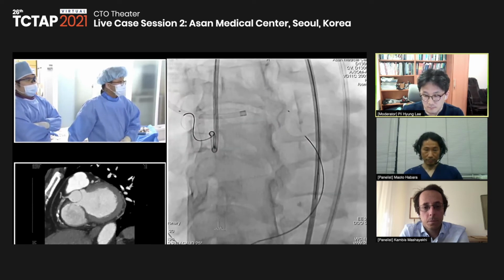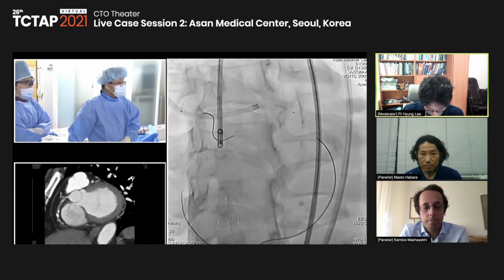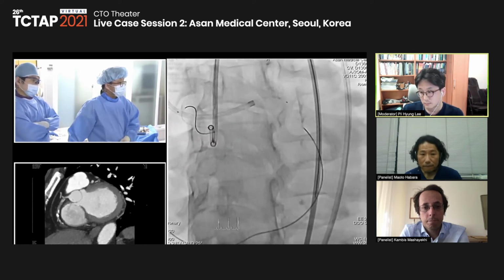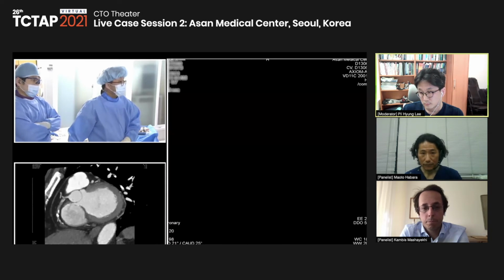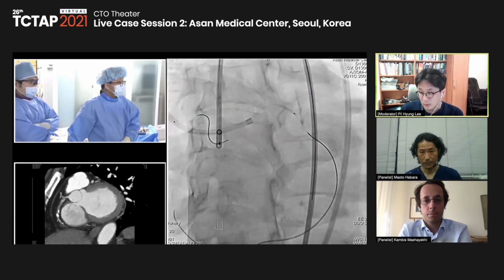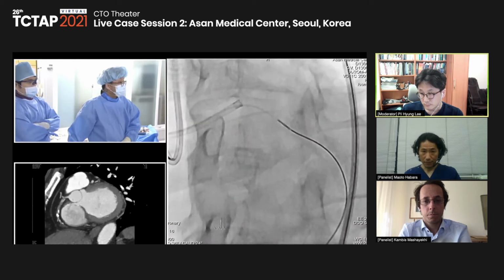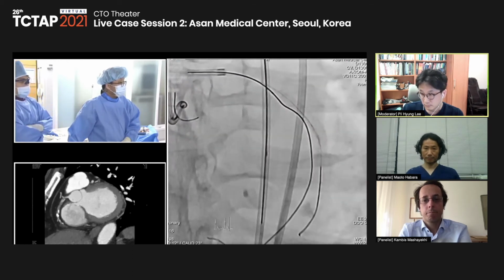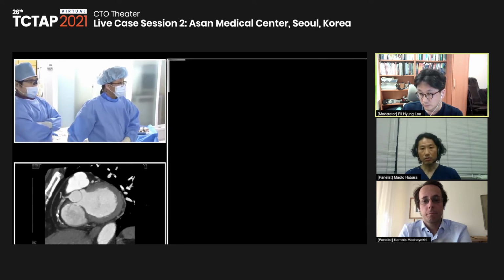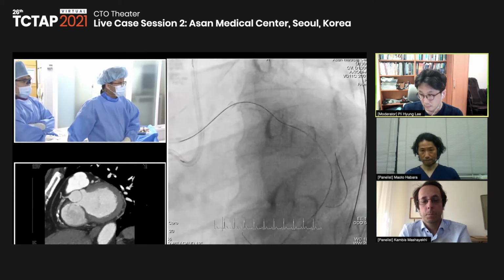So what I did, I tried to remove some factors that precluded the microcatheter advancement. I tried to balloon the stent throat with a 1.0 and 1.25 balloon, but it didn't go in easily. So I tried to use another microcatheter. It didn't go in, so I did a balloon anchoring technique through the circumflex, which was stented again. I used a 2.5 balloon and anchored it.